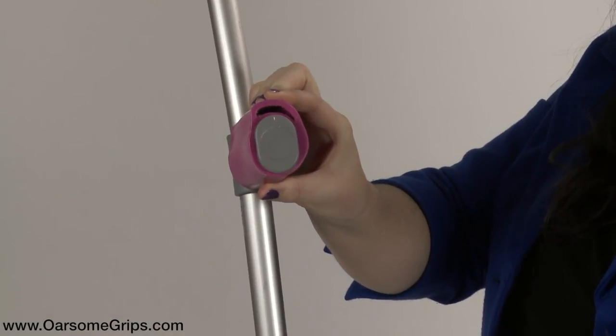You can use the Awesome Grips either way around, as long as the shock absorbing section is at the top. You can have the logo facing away from you or towards you.